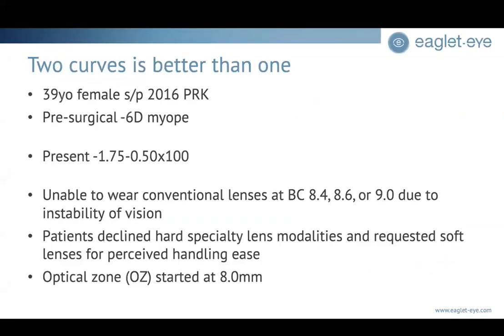Now, here's a cool case that we presented earlier this year at the GSLS. It is a case of a patient who is 39 years old. Her history is remarkable for having PRK, so her ocular shape is very flat on the top. What that does with many patients is result in a mismatch from a commercially available prolate contact lens shape that's round with their tabletop eye shape.